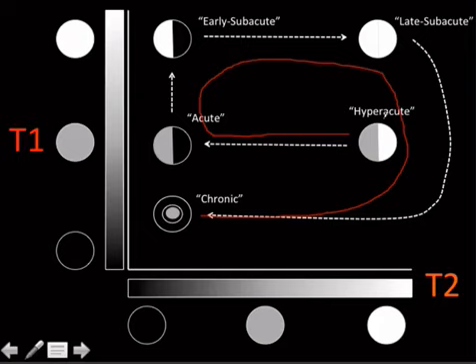And then once you do it, for practical purposes, just remember that the one that's T1 bright is subacute, and the one that's not T1 bright but is also T2 bright, so in other words, the iso T1, bright T2, that one's the hyperacute one. And if you've got that, then you pretty much got it done. Or you can just Google it every time. That's what a lot of people do, even neuro attendings, just look it up, because it doesn't come up that often, honestly. But for the test, draw the spiral.